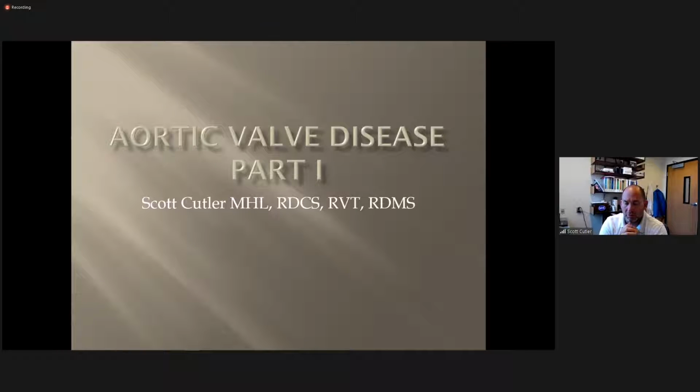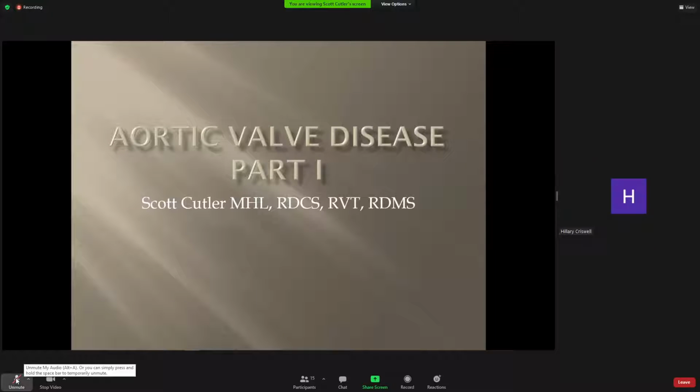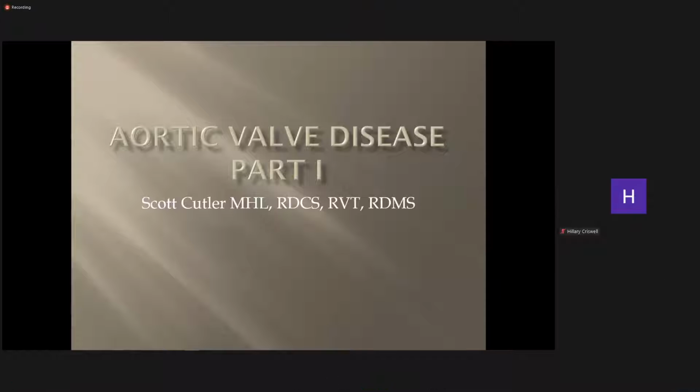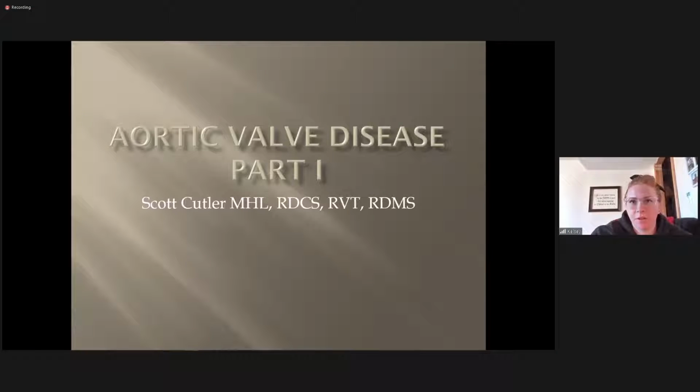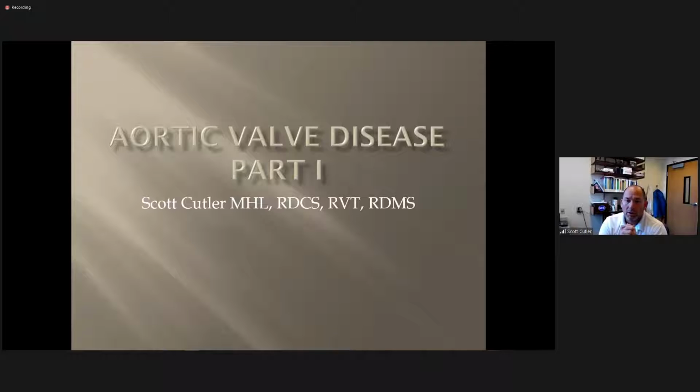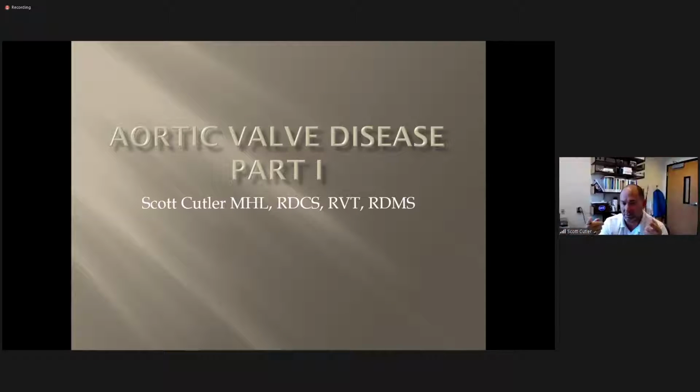What do you think you're looking for on the aortic valve? Isn't it defects? Okay, good. Give me some examples of defects. Thickening, we're looking for closure. Good. So bicuspid, tricuspid. First of all, we're looking for things directly related to the valve, right?